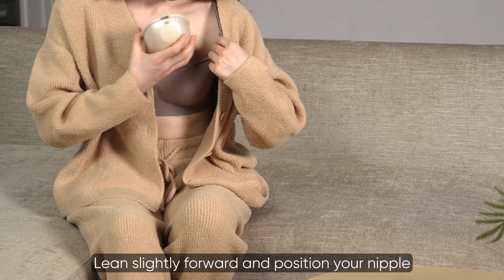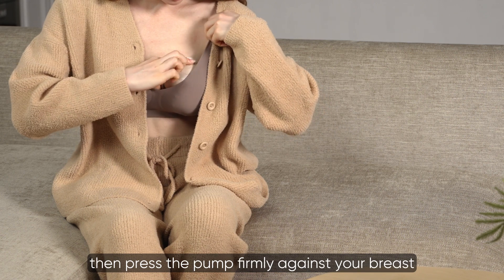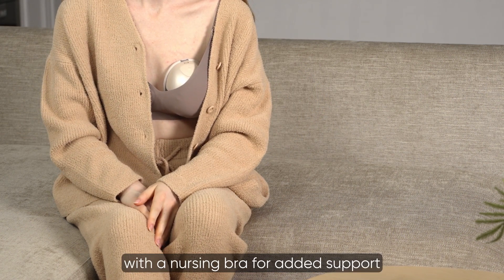Lean slightly forward and position your nipple in the center of the flange tunnel, then press the pump firmly against your breast. Secure the pump with a nursing bra for added support.